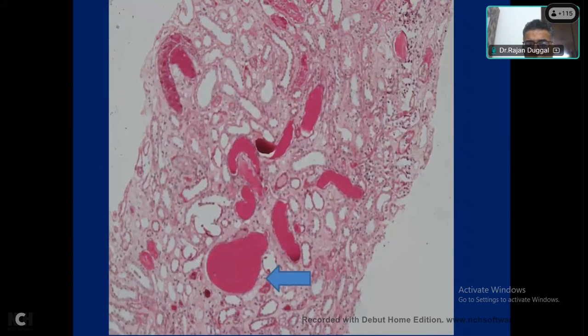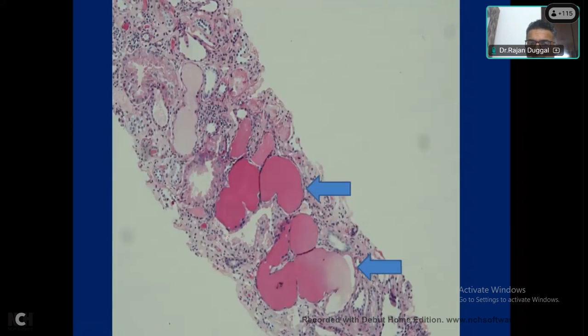And sometimes these tubular casts are very broad. So these are called broad hyaline casts, and whenever you see broad hyaline casts, it suggests chronic kidney injury or CKD. Okay, similarly, you can see these broad casts. One important thing: though they are broad, they are PAS positive. Okay, they are not PAS negative.